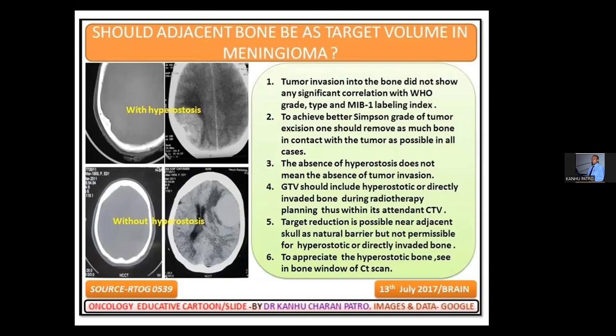Hyperostosis, there is a bony reaction in the meningioma site, skull bone reactions. So what you have to do? You have to see in the bone window. If there is some skull reaction, you have to include that bony hyperostosis area in your GTV.